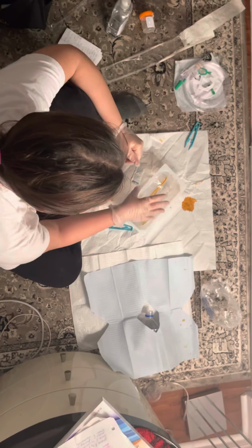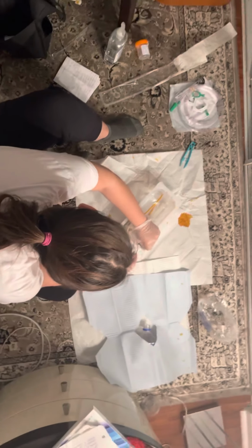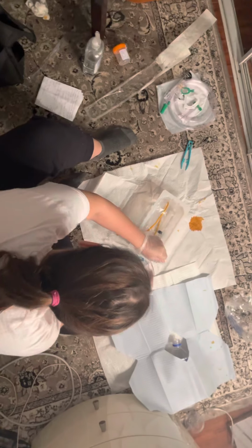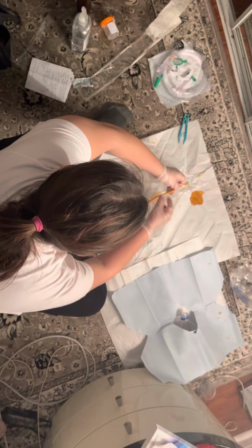So once I have done that, I'm going to begin by lubricating my catheter. So I'm going to open my lubricant. I'm going to place it on the side here. I'm going to open up my catheter.